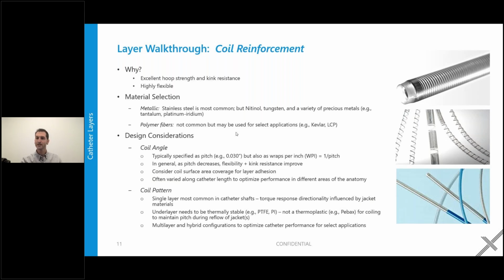But when you torque it towards the direction where it actually starts to tighten the coil, you do get a little bit of torque response out of that. Still nothing like what you're going to get from braid. But if you wrap them back and forth, you start to have the coils constrain each other. One's trying to loosen up, but the other one's trying to constrain down on it. And so you get some of that torque response back.